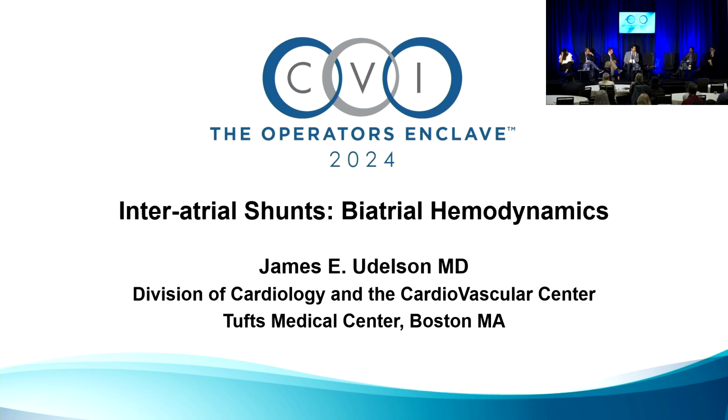In other words, have we not understood properly the LA as a chamber in between the lungs and the LV? And we all know these patients with severe MR, very dilated LAs, they oftentimes don't have big V waves in the tracing, and they may shield the lungs. So talk a little bit about the hole versus what the device is doing to the compliance. It might be that it's changing the size of the LA and offsetting something.